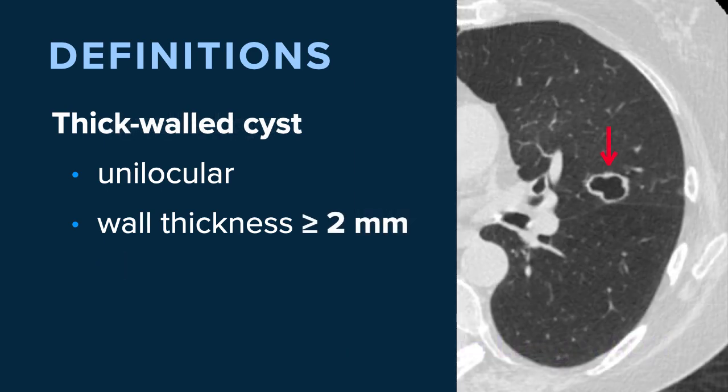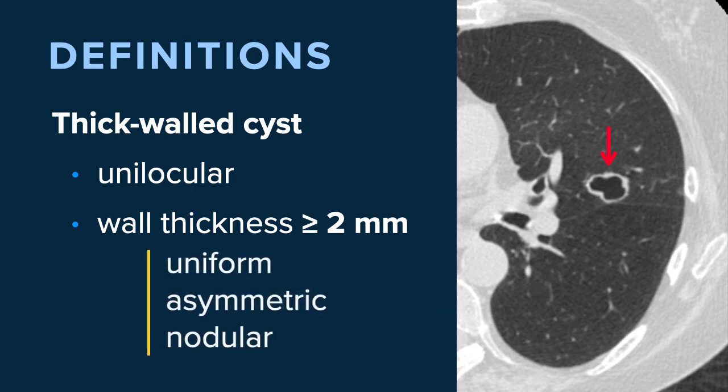So what are some atypical features? Well, thick walls. A thick-walled cyst is a unilocular cyst that has a wall thickness of two millimeters or more. This could be uniform wall thickness, or it could be asymmetric or focal nodularity. This particular example demonstrates more uniform or circumferential wall thickness of more than two millimeters.